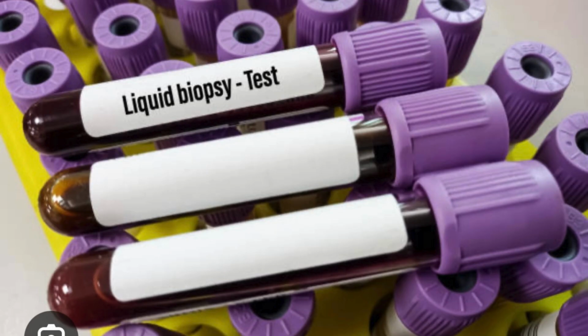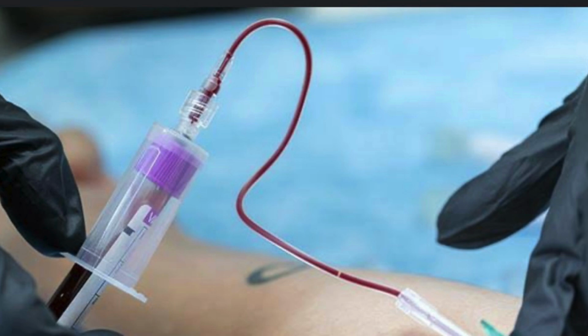For this tube, as I mentioned, one of the tests is a CBC, a complete blood count, and the next test is a sickle cell test, which I think everyone should know. There are more tests surrounding the purple top tubes, but I'm just going to leave it at the sickle cell test and the CBC.